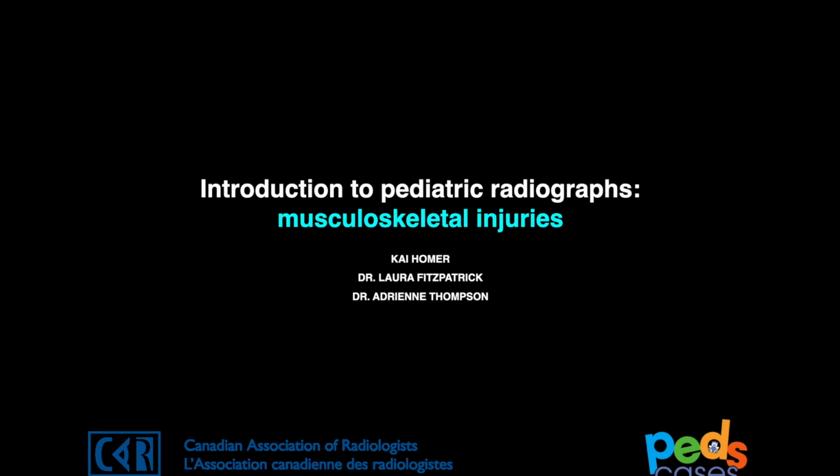Hi, my name is Dr. Kai Homer, and I'm a resident in radiology at the University of Alberta. This video is the fourth in a series discussing musculoskeletal radiology in children. We're going to focus on musculoskeletal injuries and go through some cases that'll help you understand how radiology fits into the whole clinical picture. In this fourth video, we're going to discuss ossification centers of the elbow.